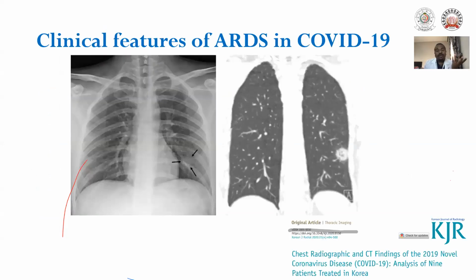There are also potential benefits of reducing and eliminating the need for invasive mechanical ventilation, such as in patients who undergo transplant, etc., which cannot be missed. Also, at this point, I just wanted to mention that the prevention of ventilator-associated lung injury and the need for sedation and all those things should be minimized for such patients.